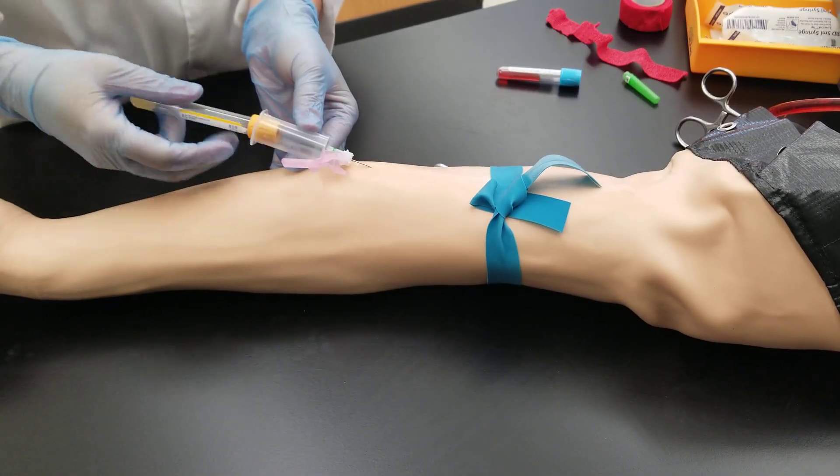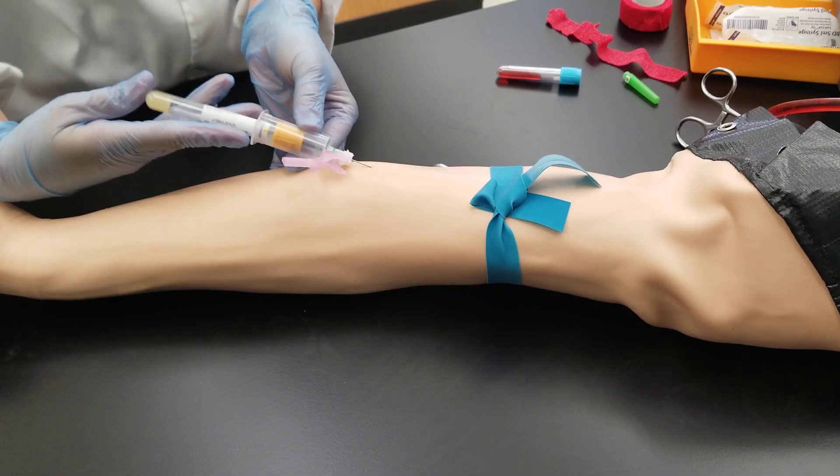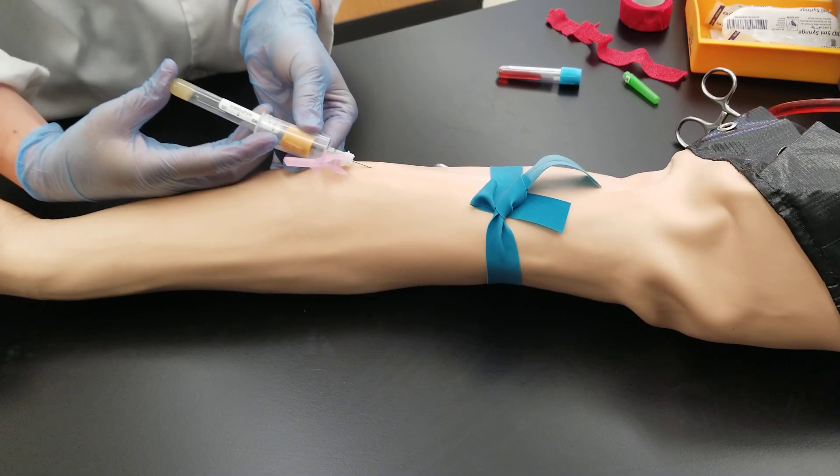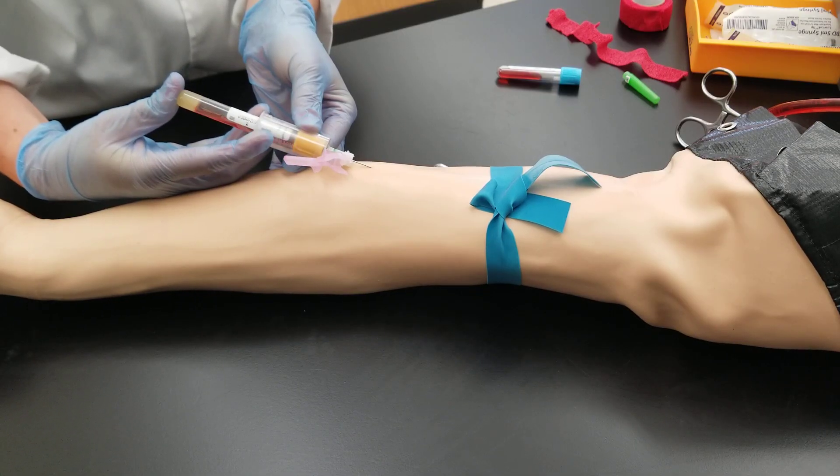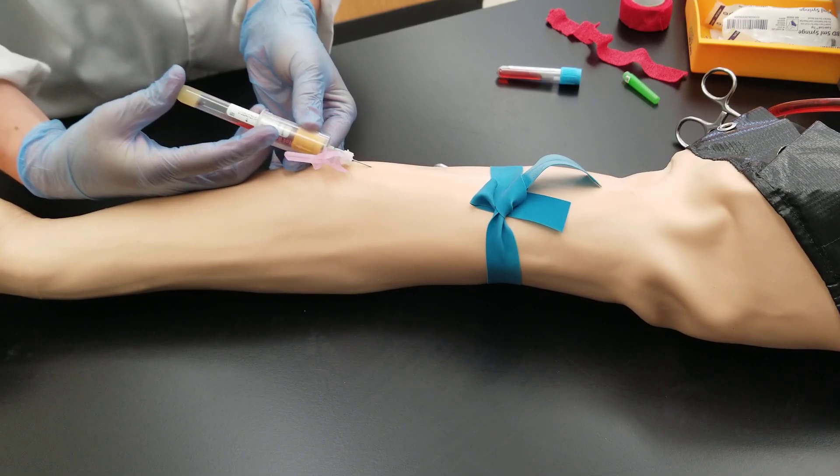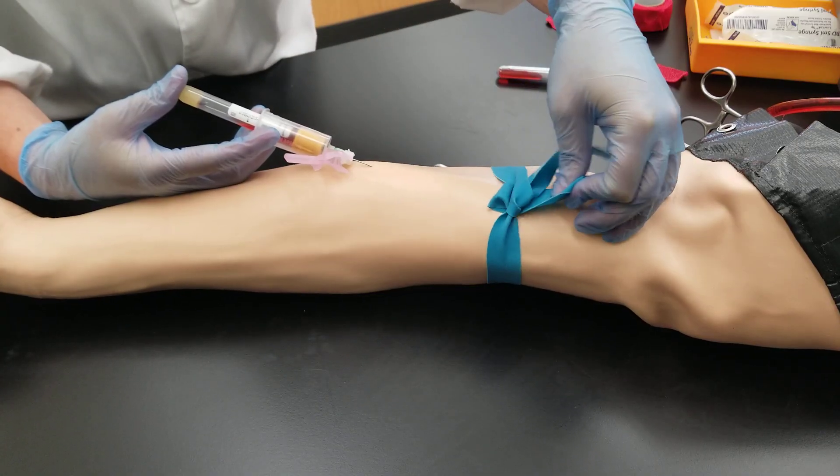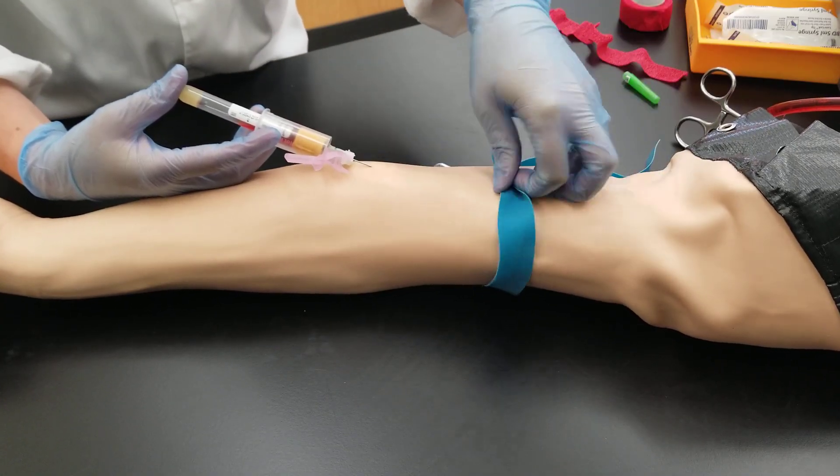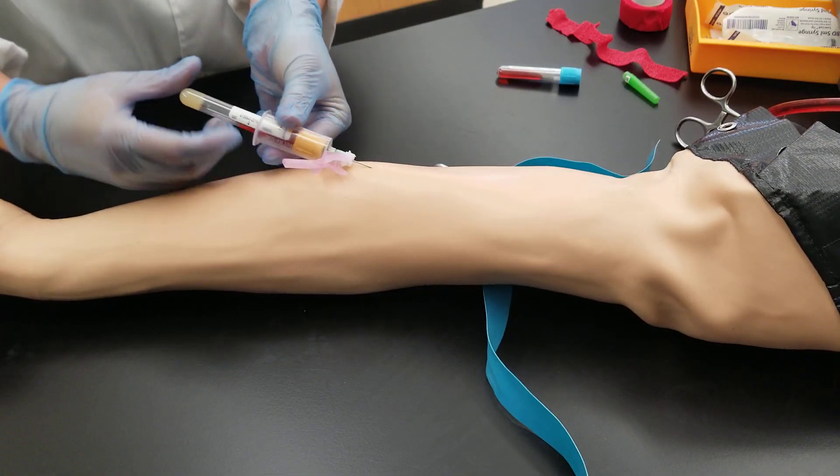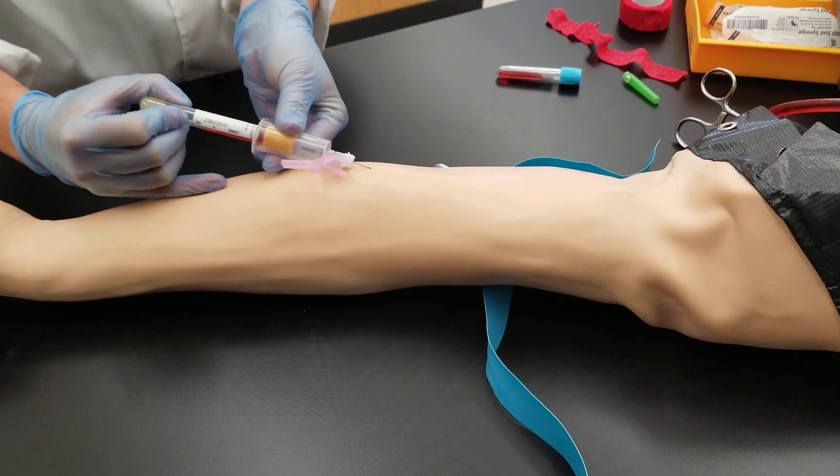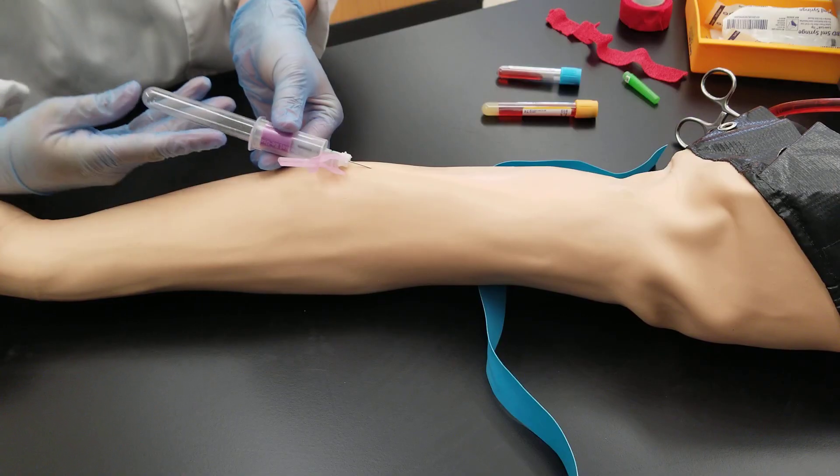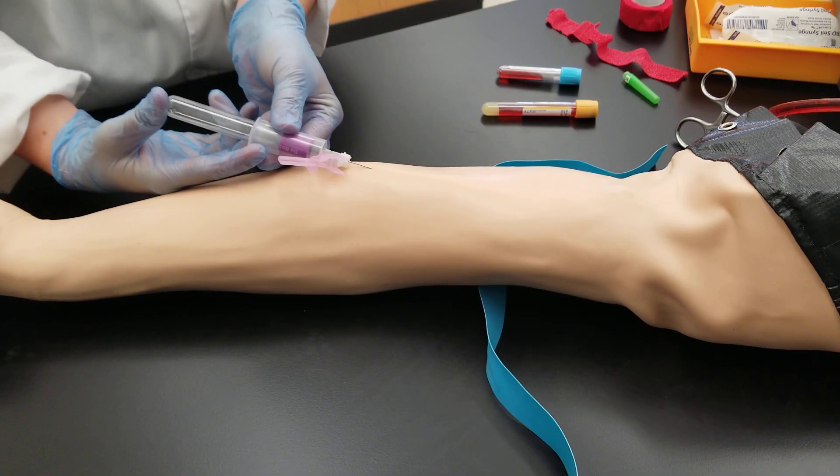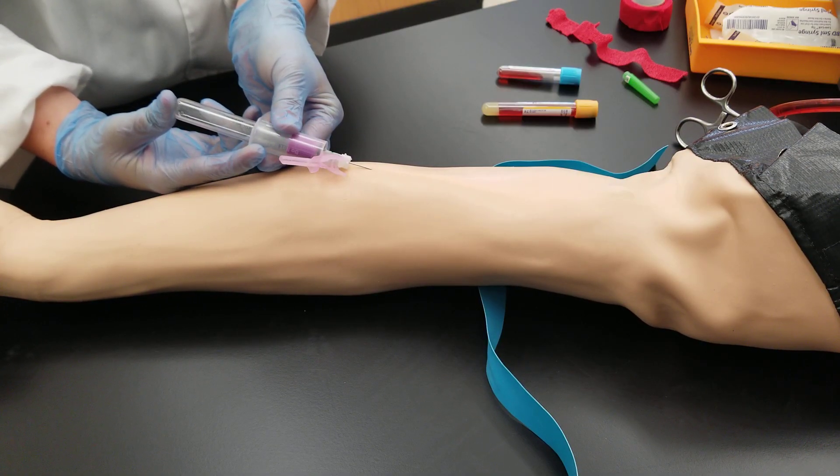I'm going to go ahead and put the gold top in. We've got good blood flow. So I'm going to let the tourniquet go. And back again, I know I'm going a little bit in and out of the vein. I'm trying to look at the camera. Do this all at once.